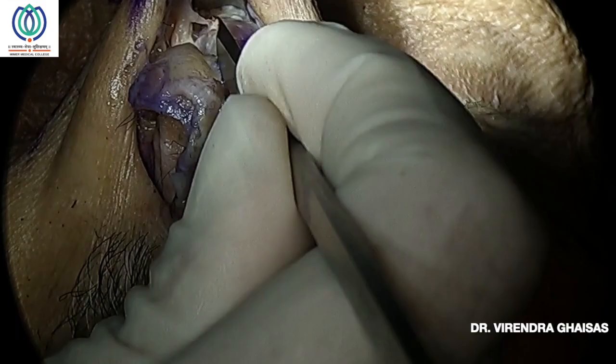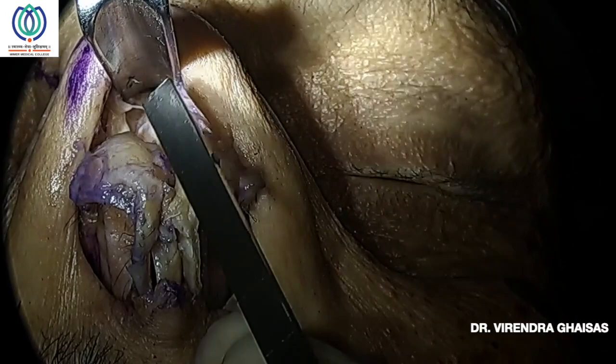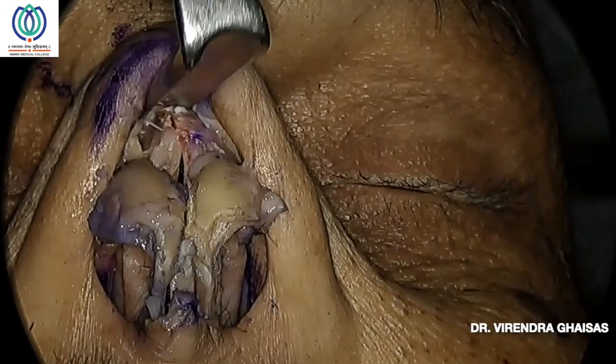It is done at the level of the nasofacial groove. If you don't respect this nasofacial groove, and if you are a little medial, then you will give a step deformity later on. So take a 3 mm osteotome, ideally a 2 mm osteotome, but practically a 2 mm osteotome breaks immediately after a few cases. So you should go for a 3 mm osteotome.